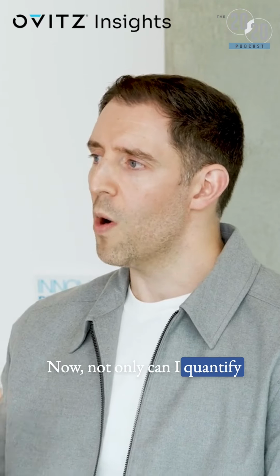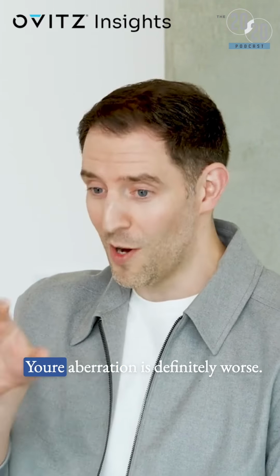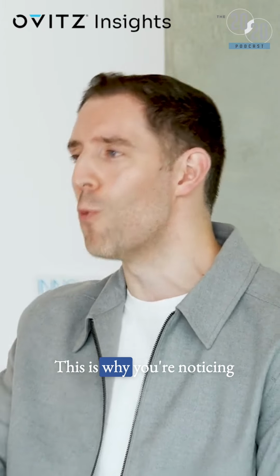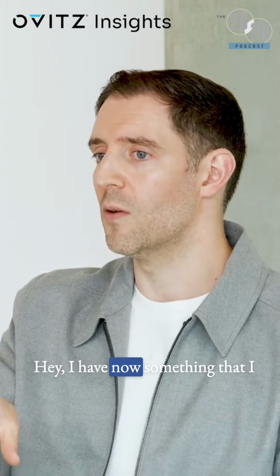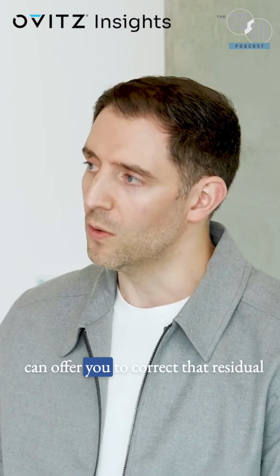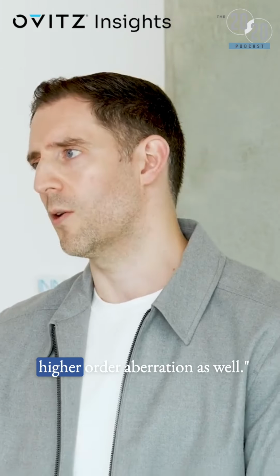Now, not only can I quantify it and say, yep, you're right, your aberration is definitely worse, this is why you're noticing more of that glare. But hey, I have now something that I can offer you to correct that residual higher order aberration as well.